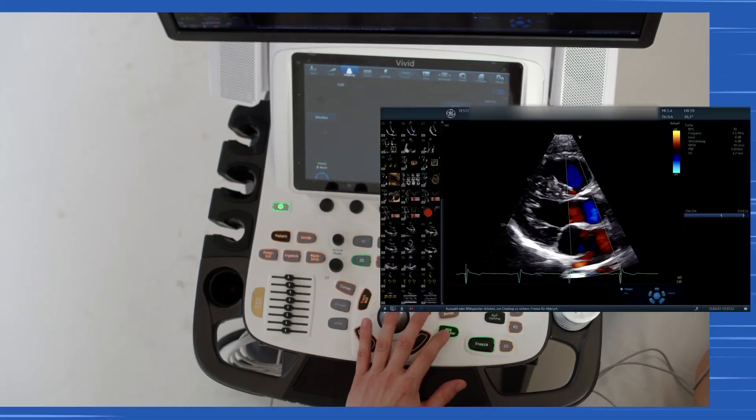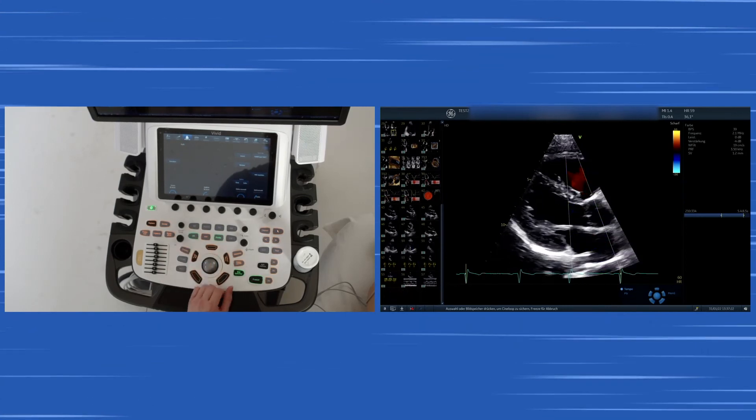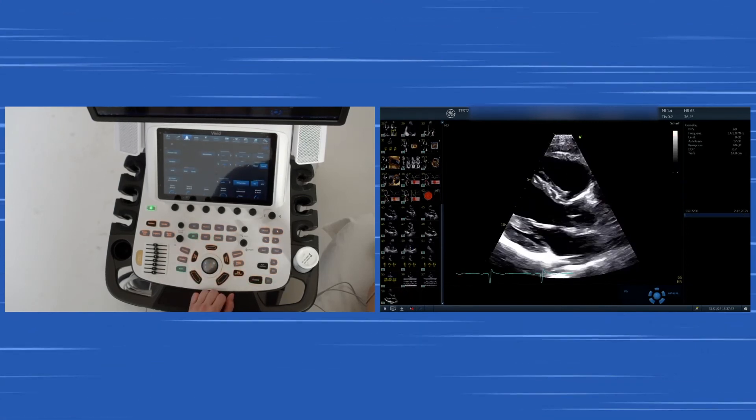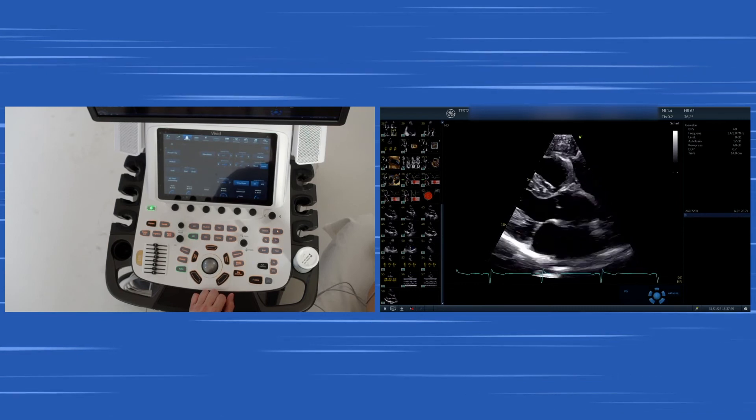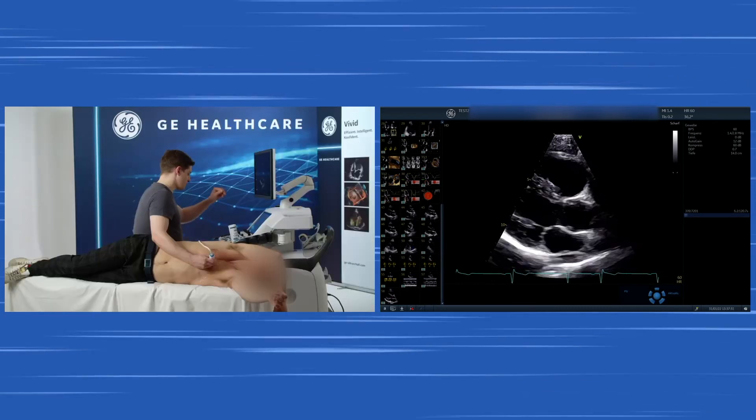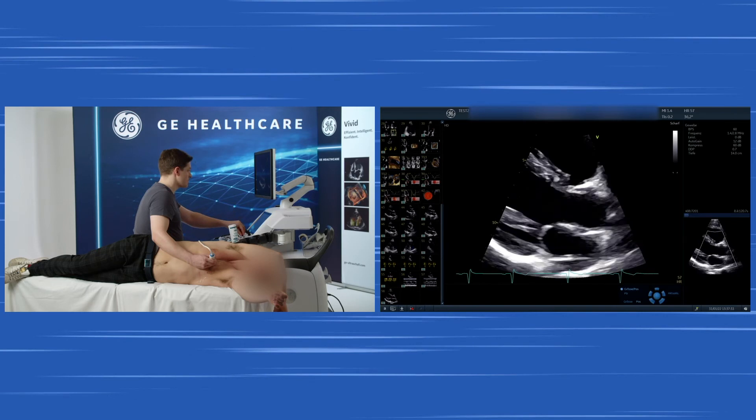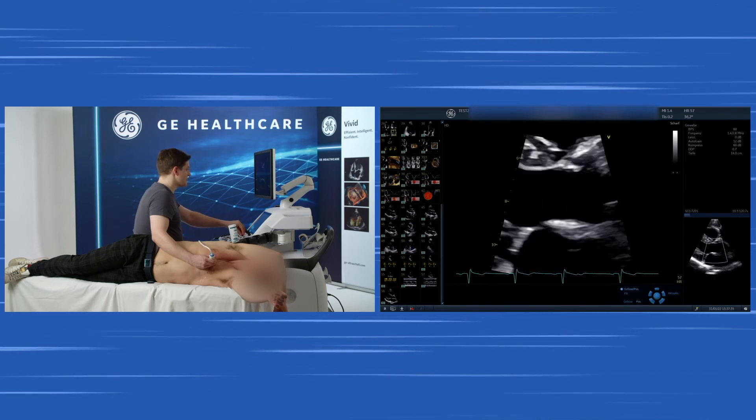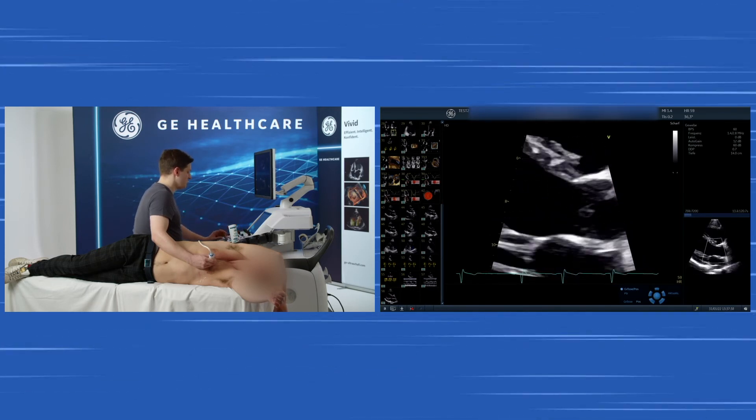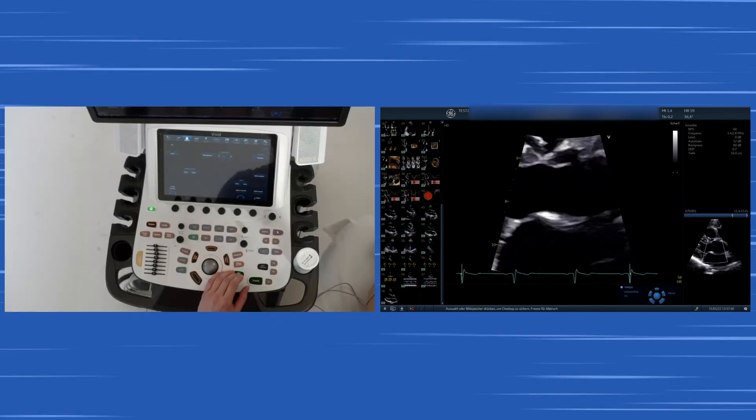Also save the images and continuing with the parasternal long axis view, you also can zoom in towards the aortic valve to visualize the valve in great detail. What you can see is that there is no anatomical variant, at least not in the parasternal long axis present.